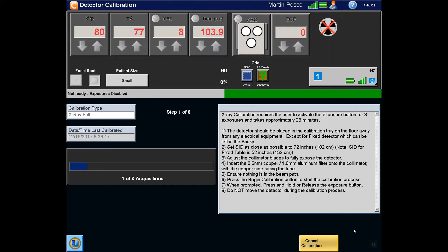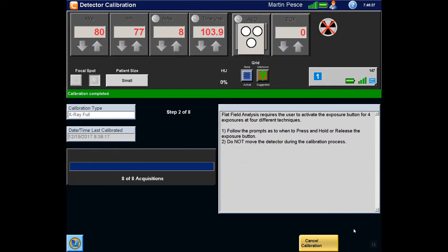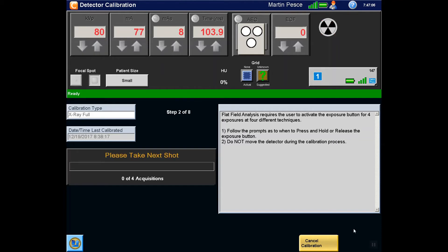To save time, we will skip ahead to Step 2. Step 2 will require the radiographer to capture 4 more exposures following the same sequence as Step 1.